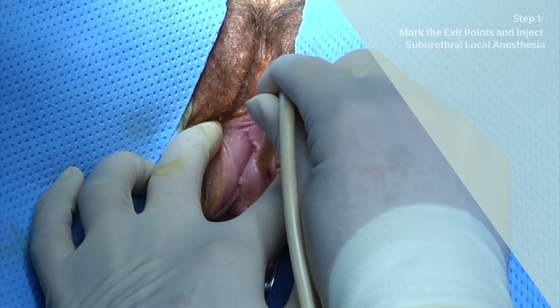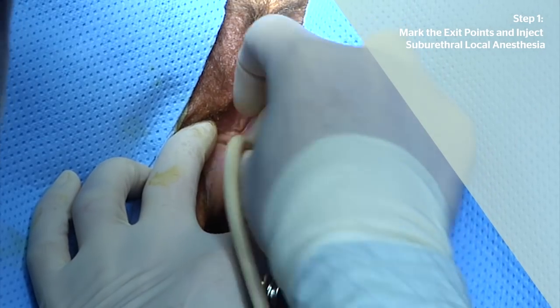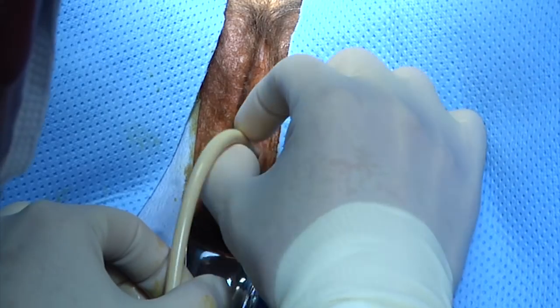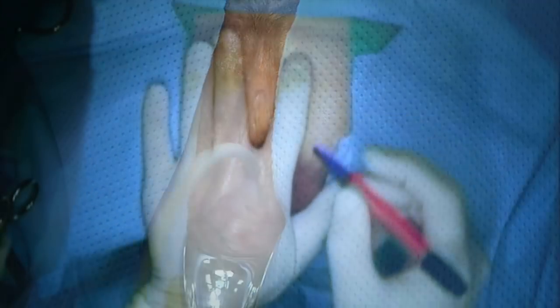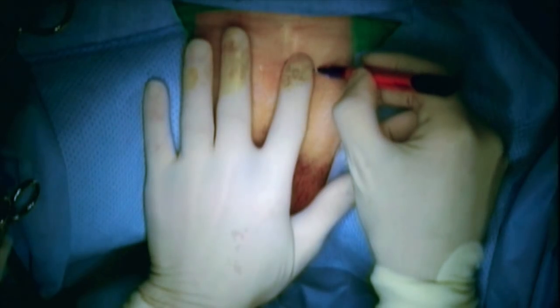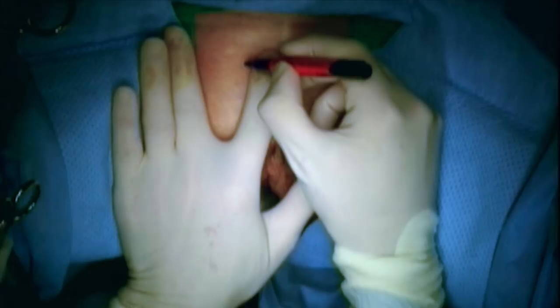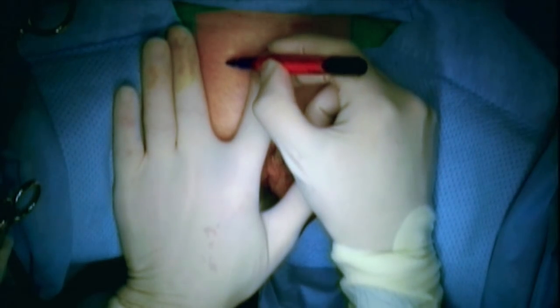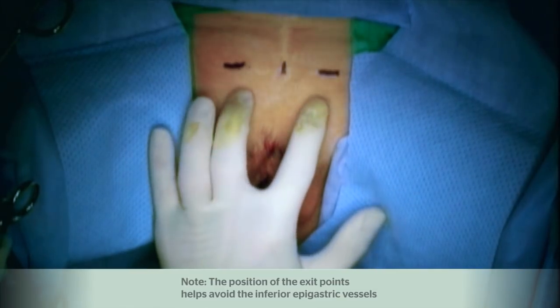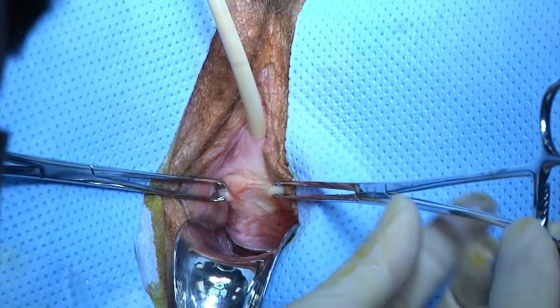Let's begin. Insert an 18 French foley catheter and leave it open to drainage. Locate and mark the two suprapubic exit sites. These should be 2 centimeters on each side of the midline, immediately above the pubic symphysis. They should be in contact with the dorsal aspect of the pubic bone, in order to avoid the inferior epigastric vessels.